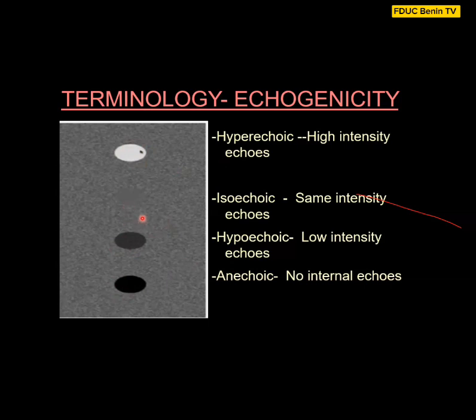And then we'll talk about isoechoic. Usually this is used especially when you're seeing a pathology, so you relate it to the normal structures. Isoechoic is what you are seeing that is similar in echo, maybe to the myometrium, or similar in echo to the vertebrae. That's when you use isoechoic: when the pathology or whatever you are seeing has similar intensity to a structure. Hyperechoic, we also call echogenic. So something that is echogenic is very bright. Then anechoic has another term, which is sonolucent.